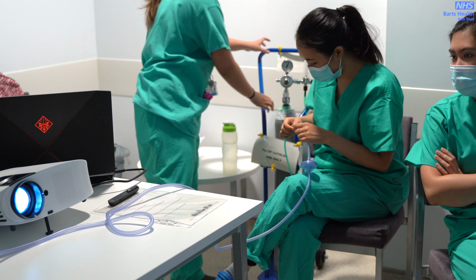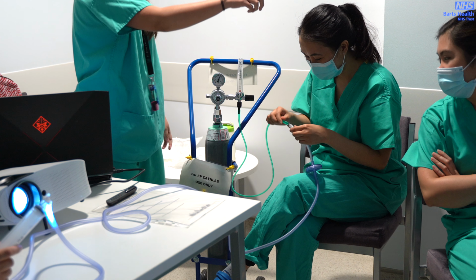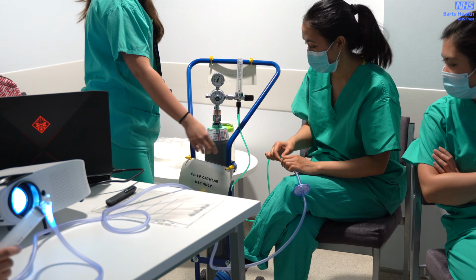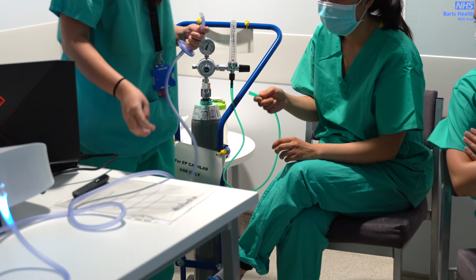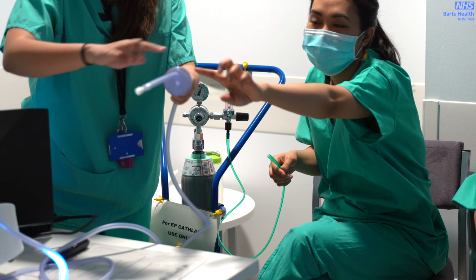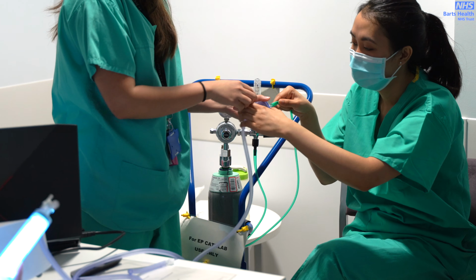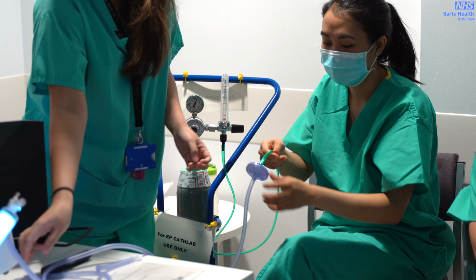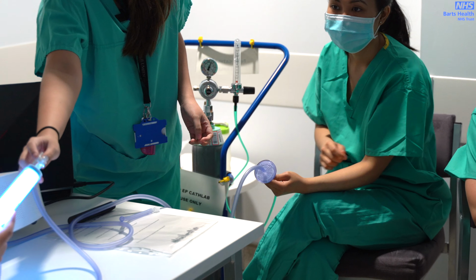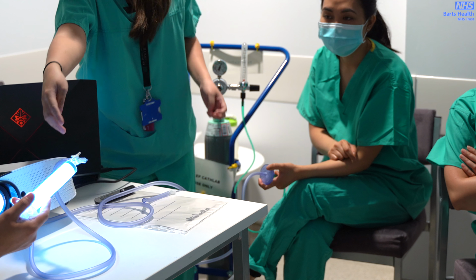The green tubing is unsterile. Basically, how you set it up: this will come out sterile. You just remove this tip and connect it to the green tubing. The other end will be connected through a 3-way tap, and the side port will be the 50 ml syringe.